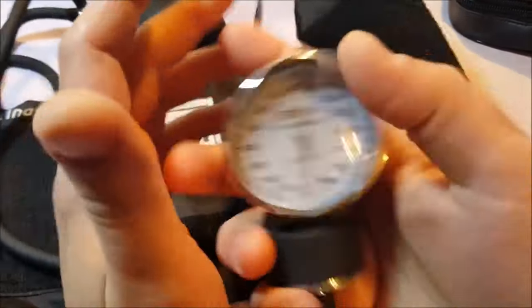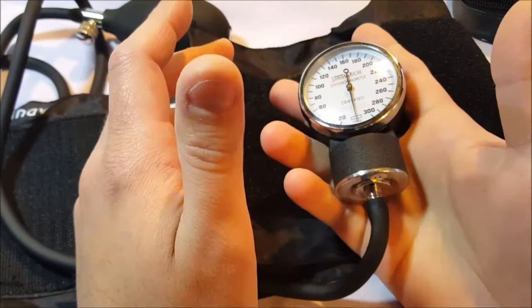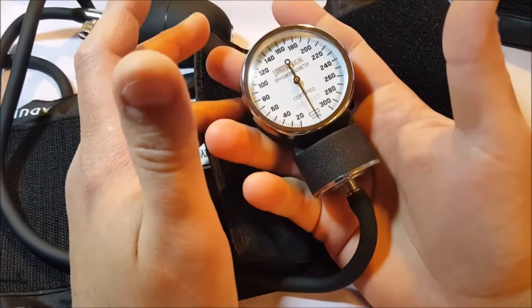It does feel, you know, nicely made. It has a nice heft to it — to the manometer.